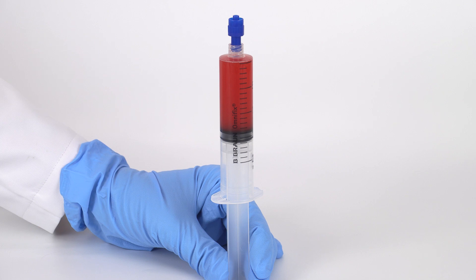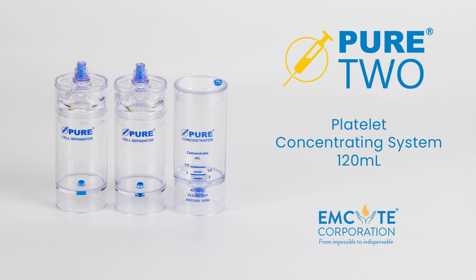This concludes our processing video for M-Site's Pure2 120-milliliter platelet concentrating system.